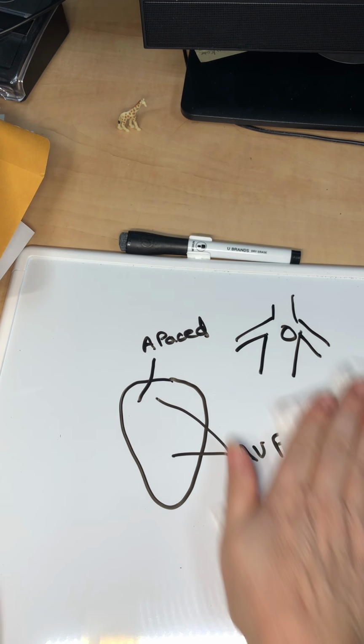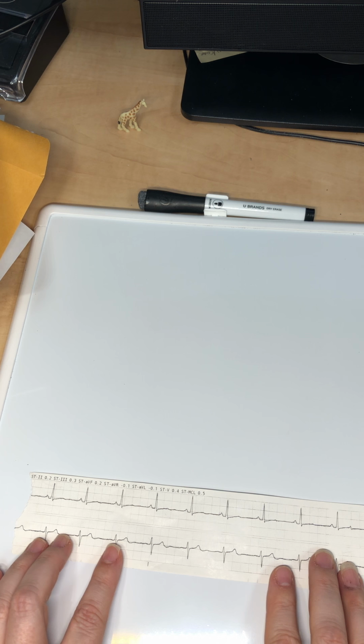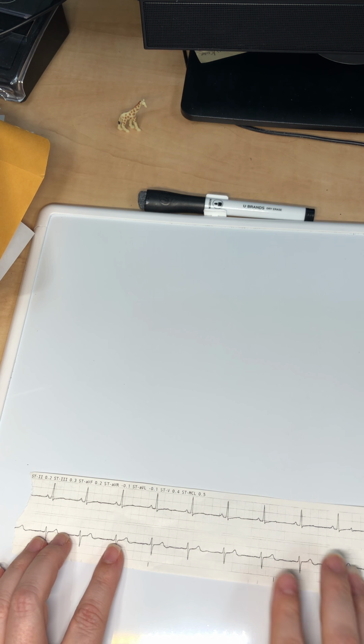And before I leave, I just want to tell you that when you see something on the monitor, don't always believe that that is what is happening in the patient's heart. You have to check the patient. We have seen time and time again a patient who would have a beautiful sinus rhythm, kid you not. They would look like this, but they're unresponsive and they have no pulse.